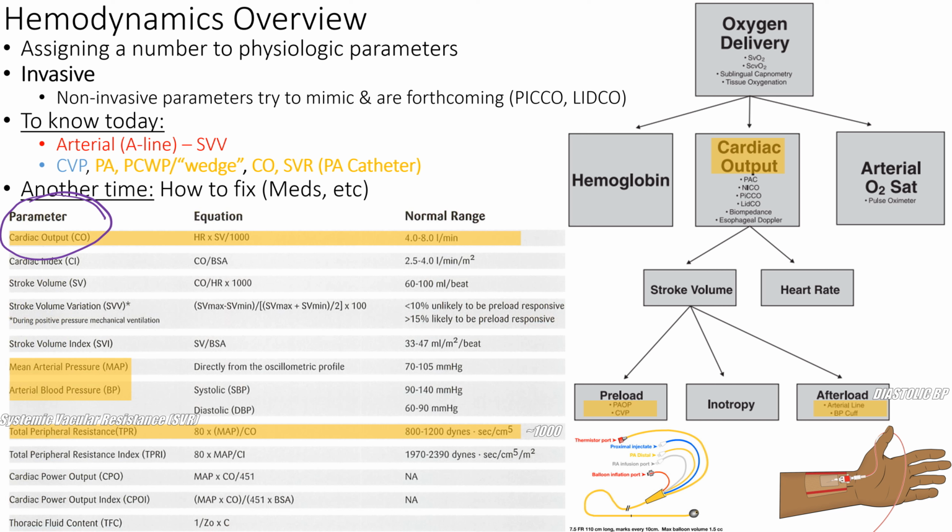And then, of course, you're familiar with MAPs and blood pressures, but we'll tell you which blood pressure to trust, whether it be your NIBP, your A-line, or the family across the room, which one is going to tell you the actual blood pressure, what a target MAP should be, and how to verify whether this blood pressure is real or not, right?